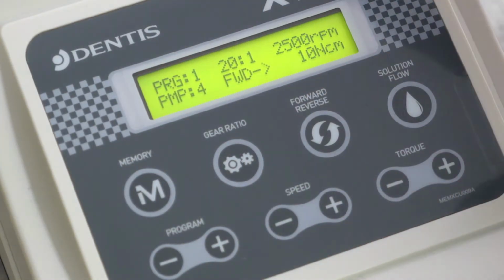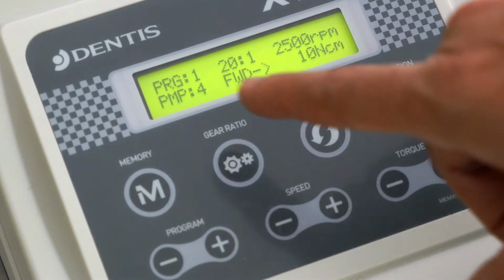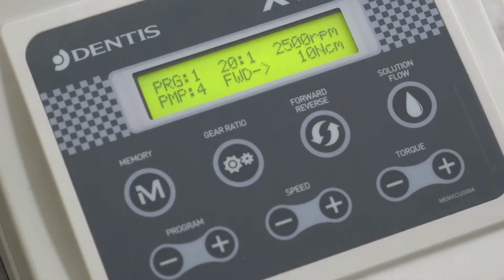So on the digital display, you have these settings that you can customize. Top left, PRG is program. I have program 1 for myself set for osteotomy. Program 2 is for implant placement. Program 3 is for bone reduction. Program 4 is for osteodensification. But let's go through these programs one by one.